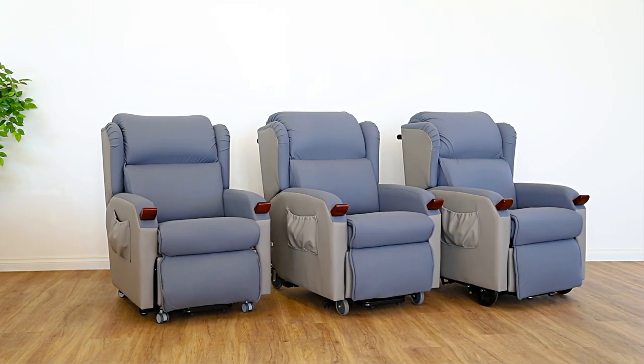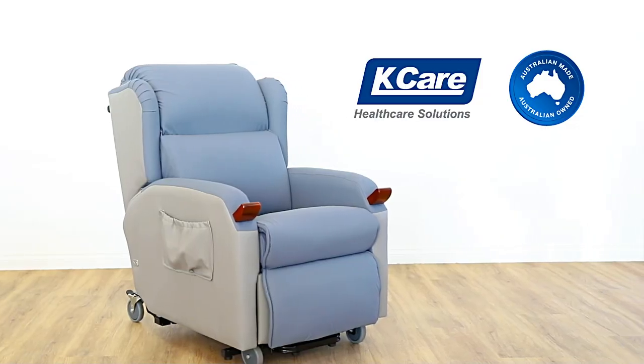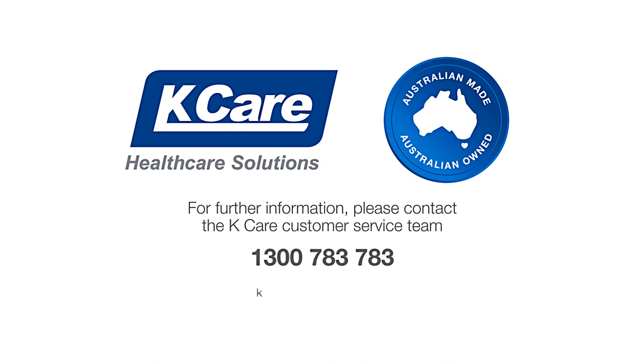The Air Comfort Compact range of lift chairs is perfect for the home or facility, designed and manufactured proudly in Australia. For further information, speak to the Kcare customer service team today.